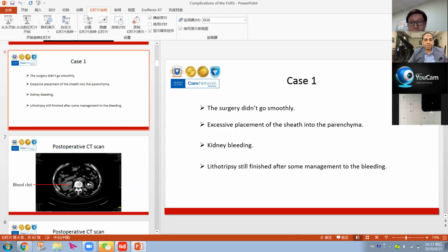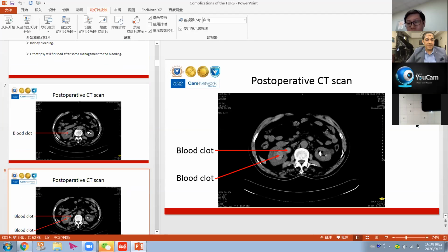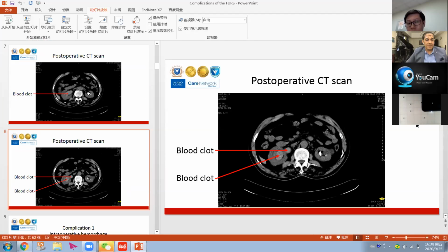before starting the procedure. The other thing, he talked about the length of the sheath. On what basis? Is it the gender only? We have some females who are tall, like the male patients. They use a shorter one for females. Is there any other basis in this selection? Okay. The length of the sheath, because he just makes it short for female and long for male. Yeah, this is clear.